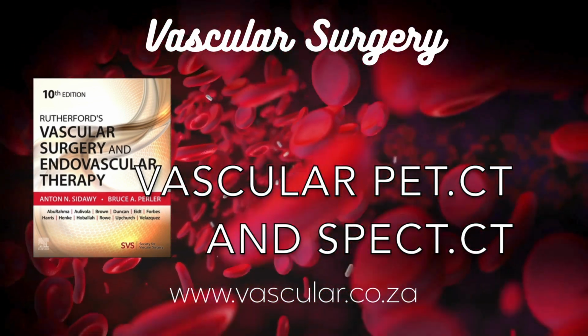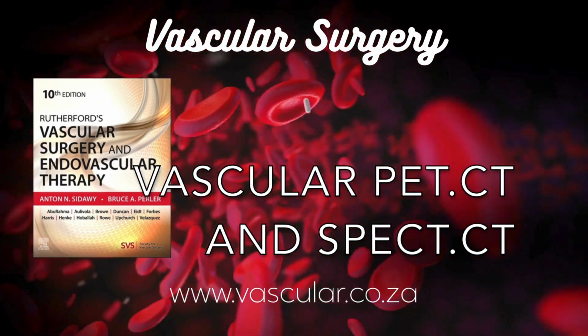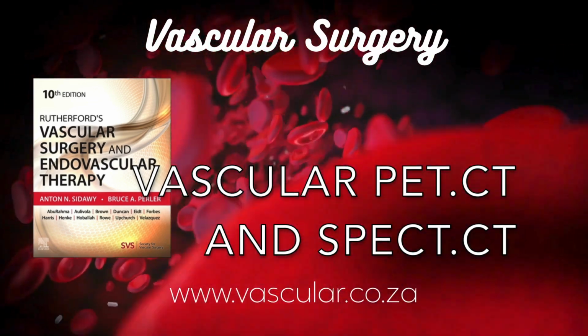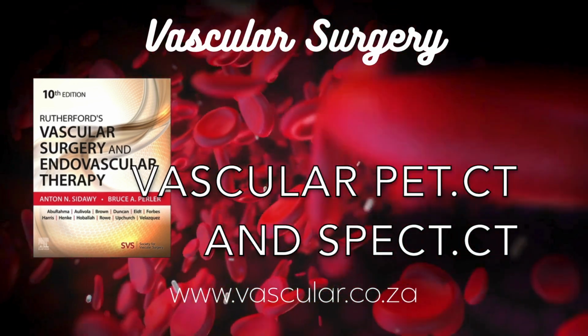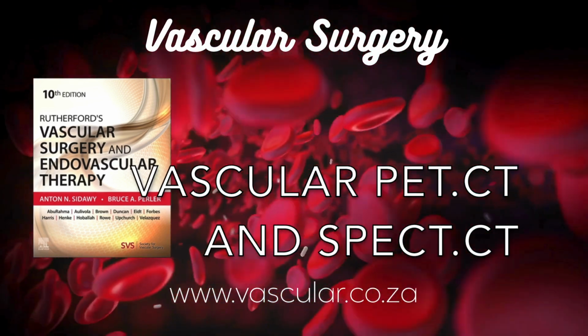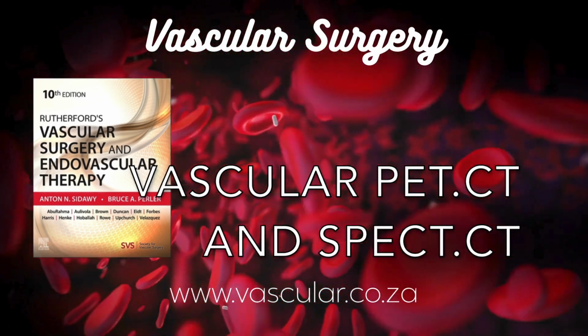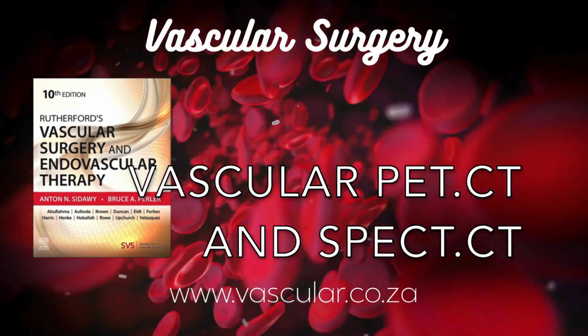So it allows for earlier diagnosis. Exactly. MRI is good for showing the structural results of inflammation, but FDG-PET can pick up the active inflammation itself very early on in the aorta and its branches. The pattern of which vessels are lit up helps distinguish between giant cell arteritis, GCA, Takayasu arteritis, TA, and others. It can even spot associated things like polymyalgia rheumatica. So it's become a key diagnostic tool.